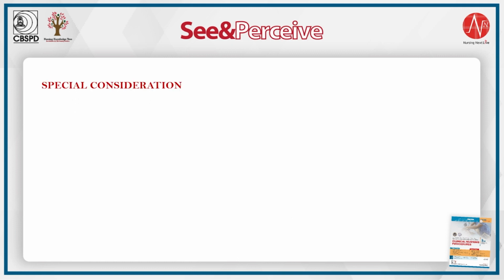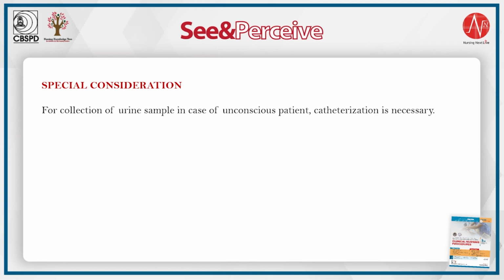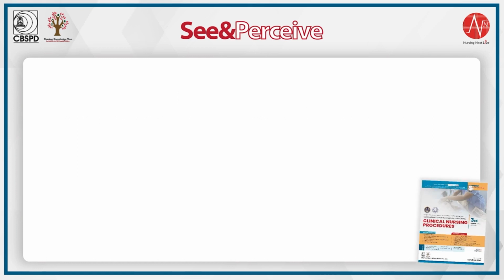Special consideration. For collection of urine sample in case of unconscious patient, catheterization is necessary.